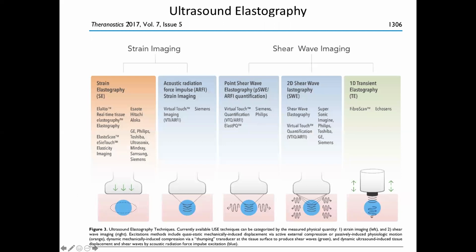Here, this is a nice review article of ultrasound shear wave imaging or strain imaging. It goes through all of the different methods of doing this. This was the first one used: you just push the darn transducer down, right? And it makes sense.